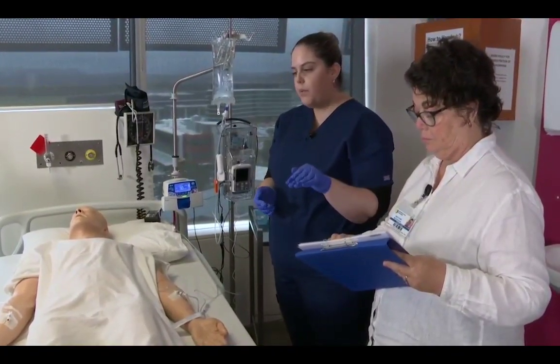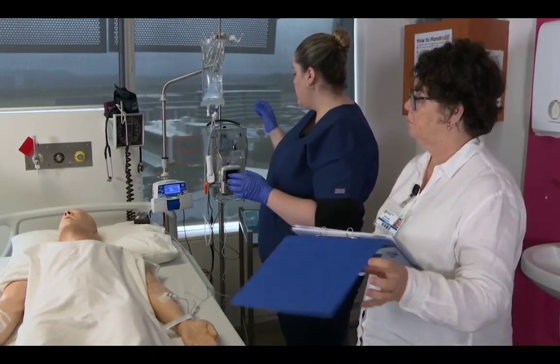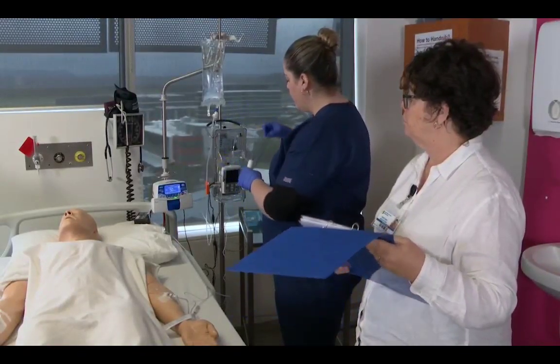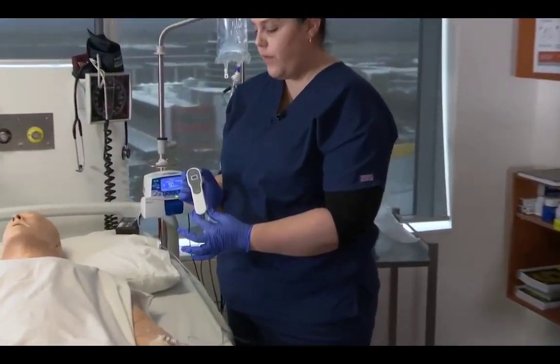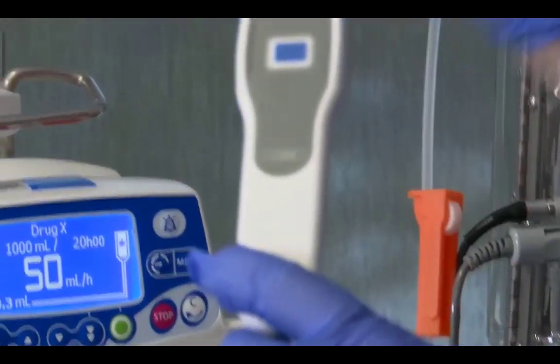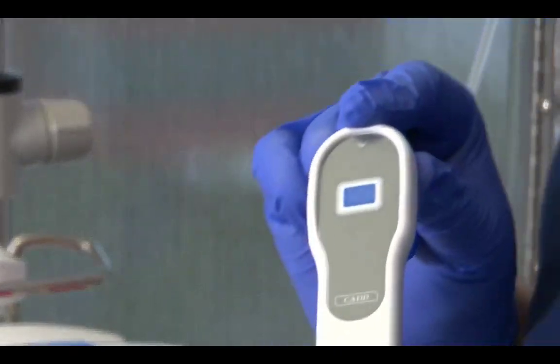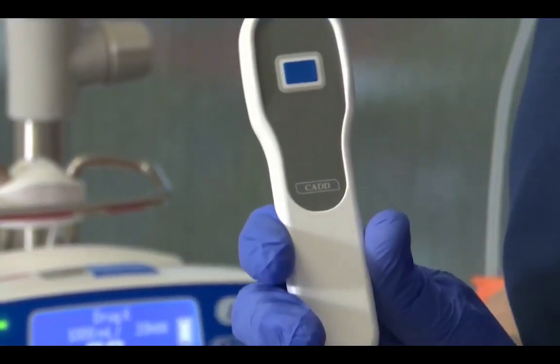I'm going to complete our paperwork and then I'm going to come back and check on you in about 10 to 15 minutes. In the meantime, I have here for you this little button. This button is how you control the PCA. Each time you press this little blue button, the PCA will deliver a volume of medication, assuming that it's not within a 5-minute window of when you previously had it.